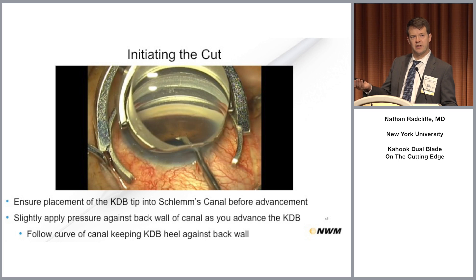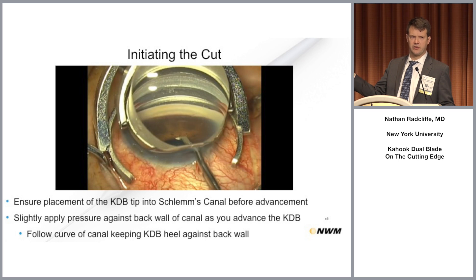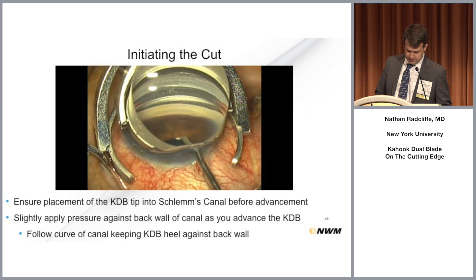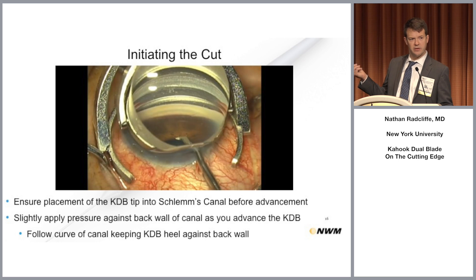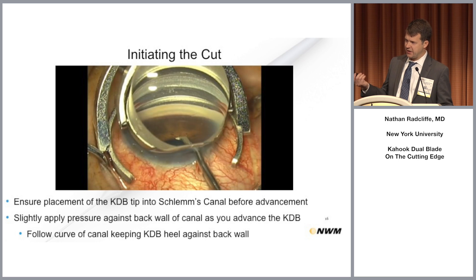If that's the case, just back up, apply a little less pressure, and move until you have good movement and can see you're making progress. You'll see the cleft of excised trabecular meshwork behind the instrument, as we saw in the video.